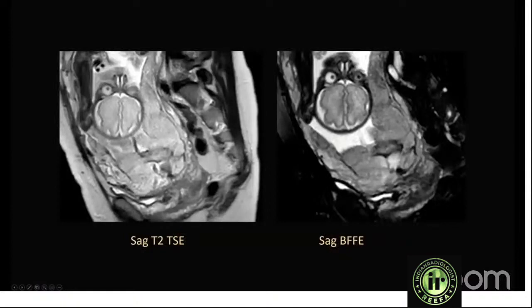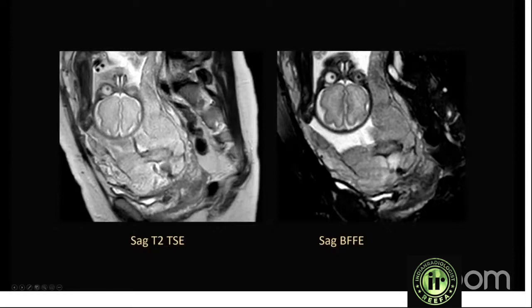Balanced FFE images are very helpful. They produce an India ink artifact between the bladder wall and the placenta, which is useful when looking for invasion into the bladder wall. In this case, the India ink artifact is preserved everywhere except for a focal area where there may be small focal invasion or focal percreta. Balanced FFE also helps differentiate between vessels and the uterine wall, since vessels appear bright on balanced FFE.